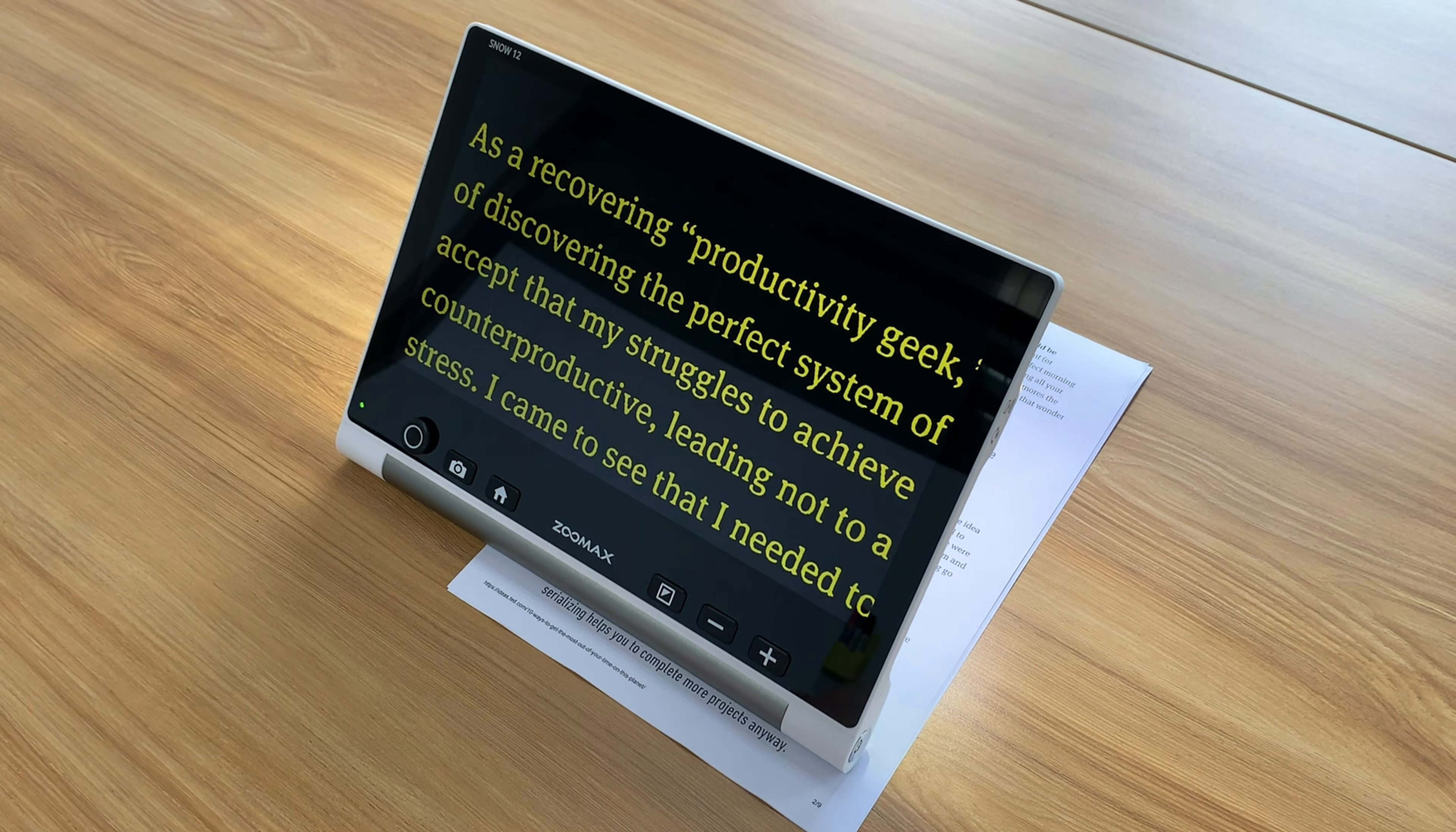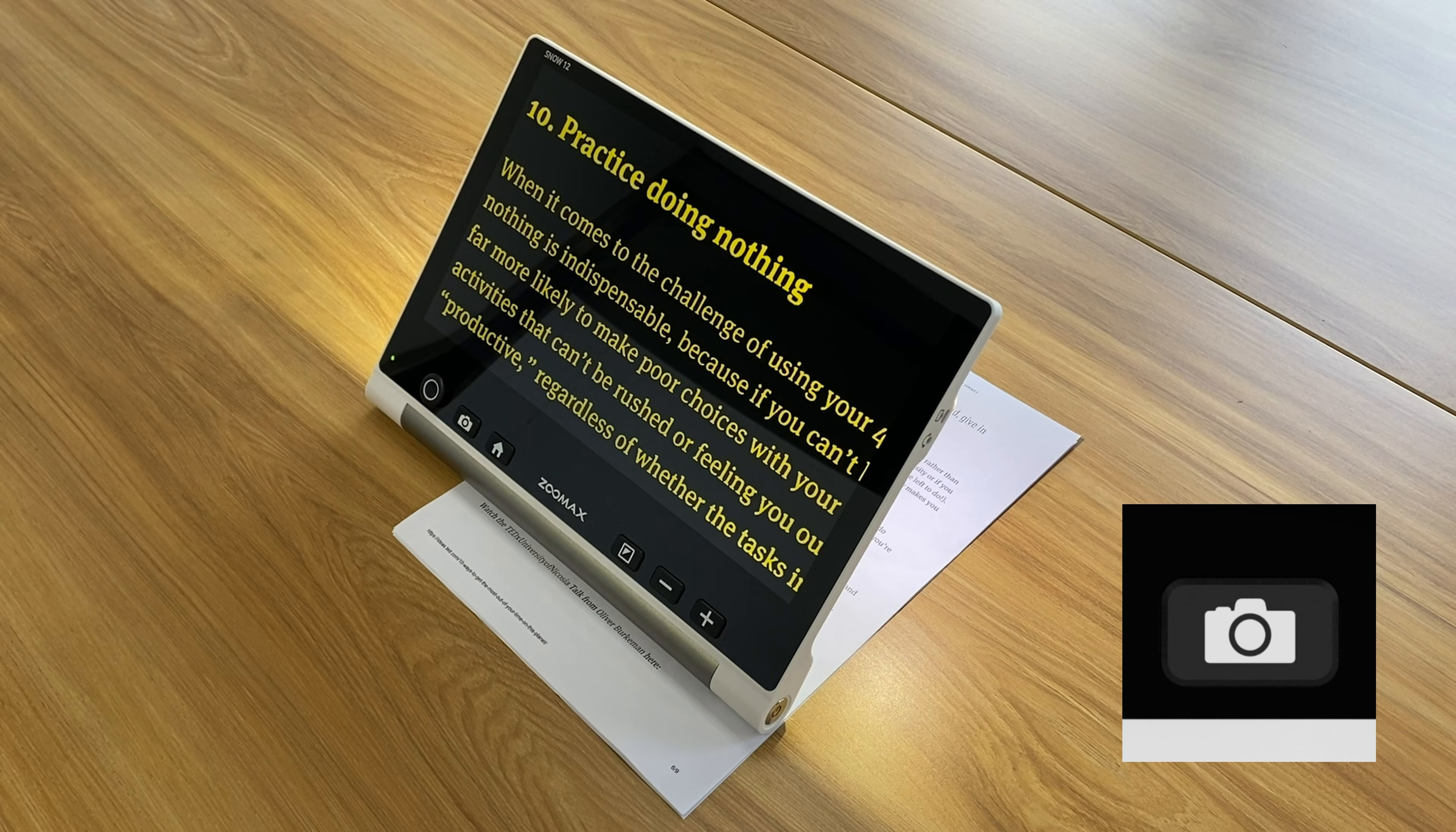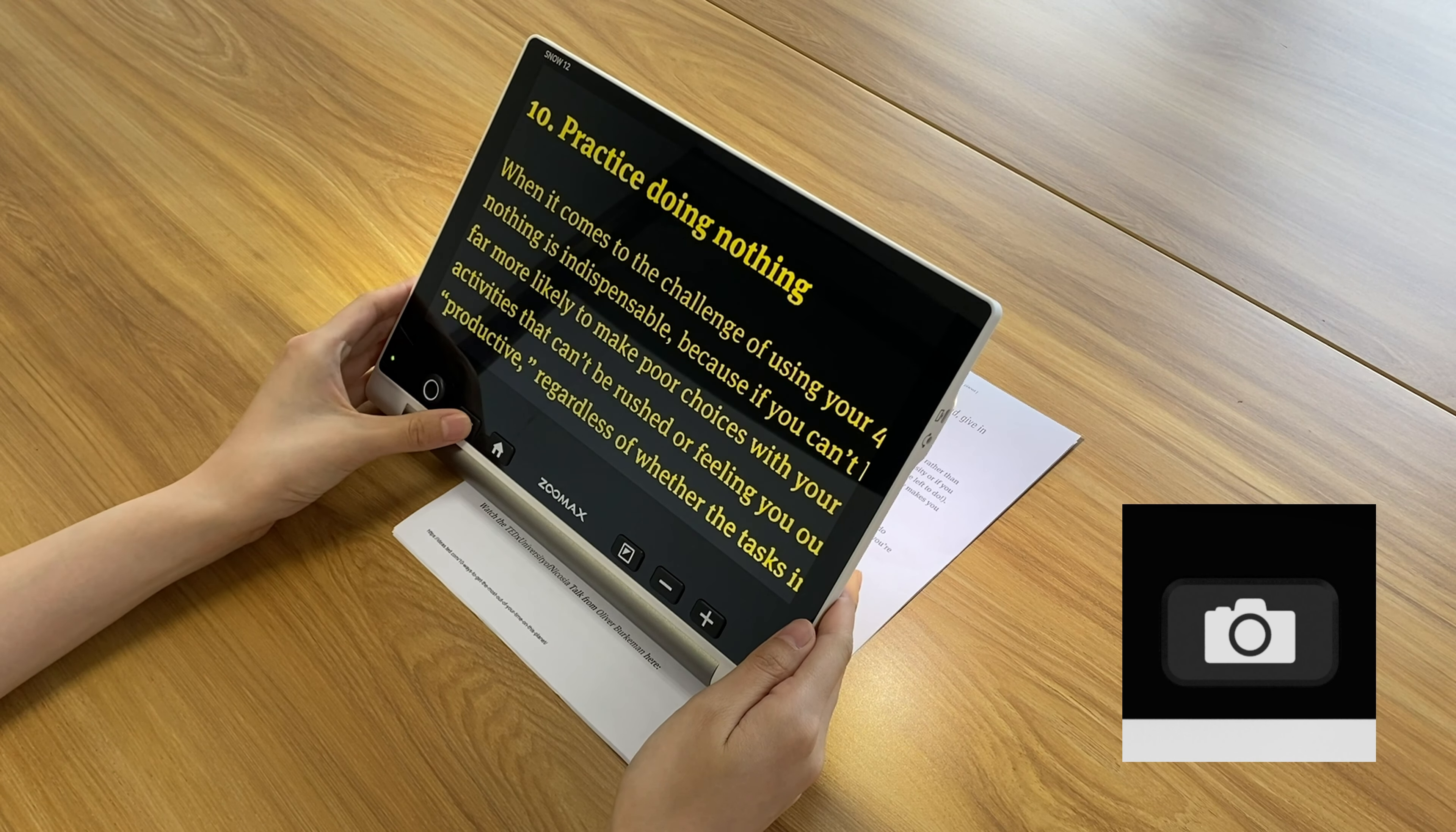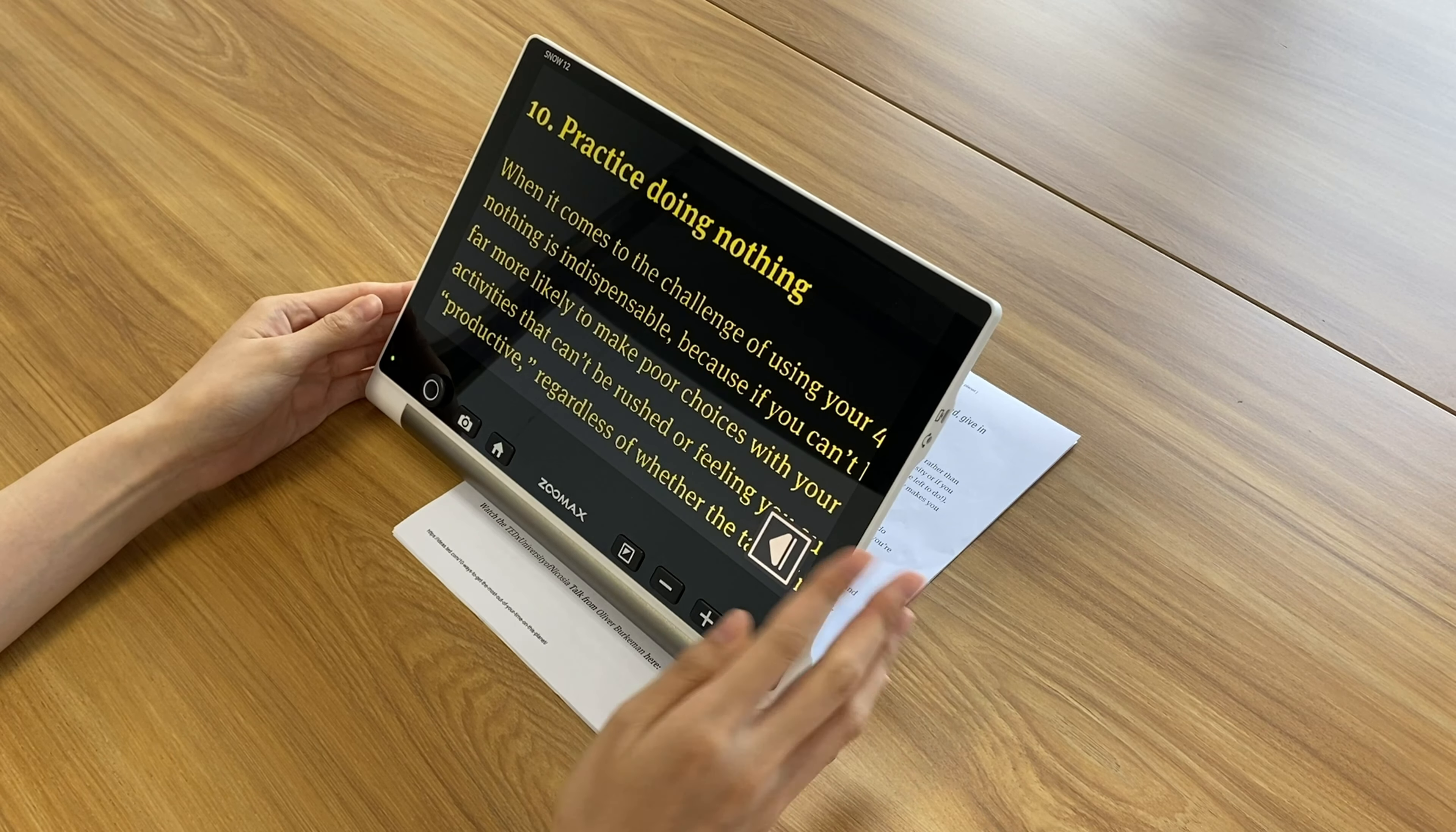Let's continue looking at the other physical buttons. To freeze the image or text you are reading or to take a picture of the object or content you are looking at, gently press the freeze button to access it. To save the frozen image, tap the icon over here.